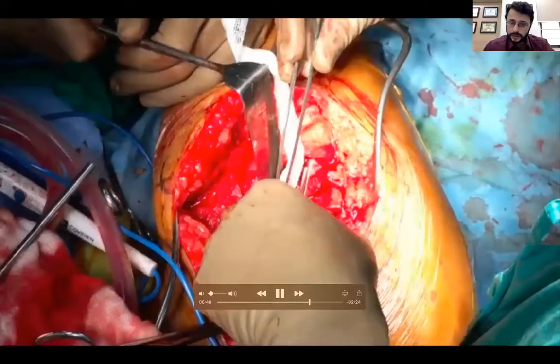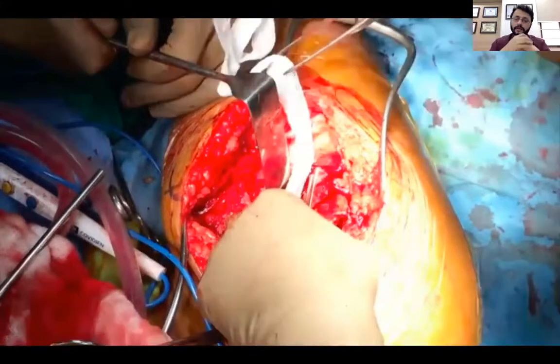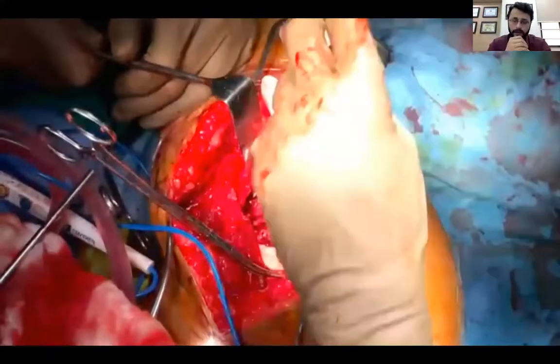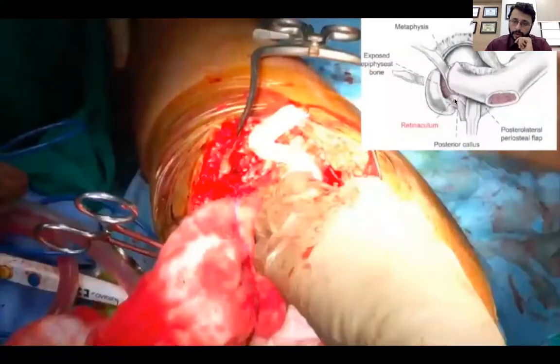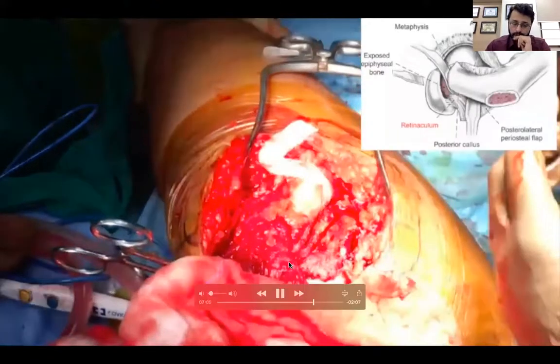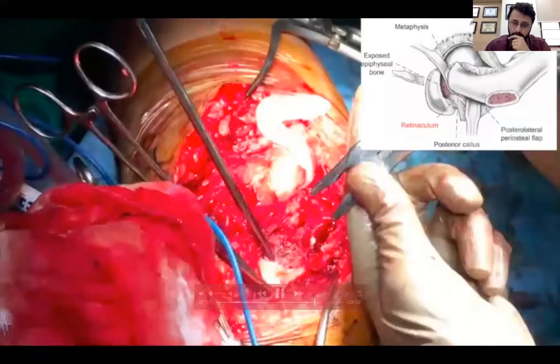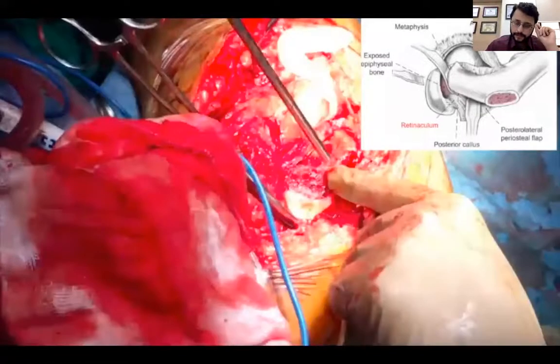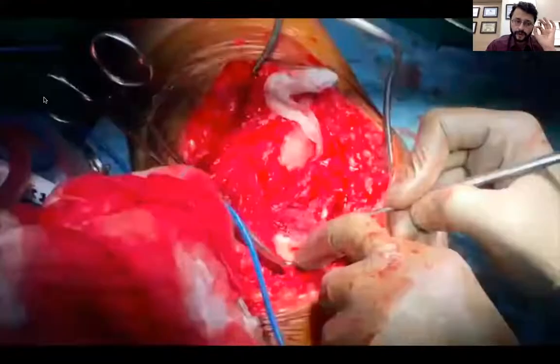Once we do that, this femoral head becomes very unstable. So that is where we usually pack the acetabulum with the help of a roller pack, otherwise it just flips back into the acetabular cavity. And then we start removing all the callus off here, which is a posteromedial callus. Again, this is a very slow process. This takes about 15 minutes of slow work to remove that callus. And there is also some amount of shortening of the femoral neck which is created. So this is how it is.